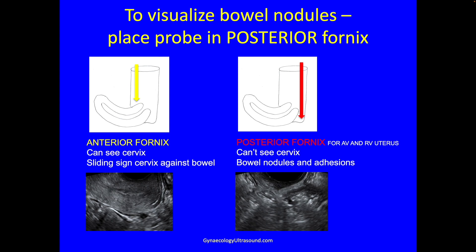To look at bowel nodules you really need to go through the posterior fornix, because this is where you'll be closer to bowel — this is bowel here — and you will be able to see nodules and adhesions if they're there, if you look carefully.